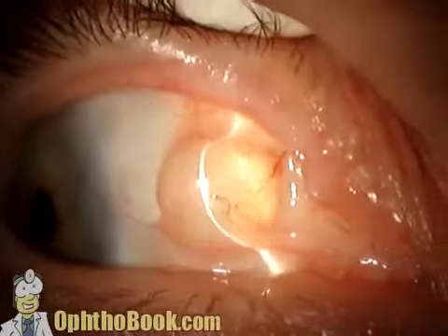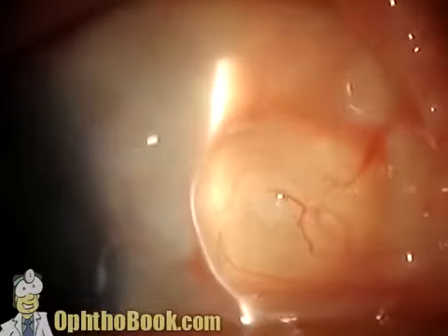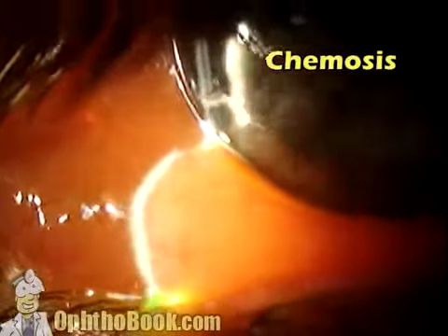It's benign because it's clear, and anytime you have something clear, you can always use your thin slit beam and get a good cross-section and gauge depth a little bit closer. This is swelling over in the white part of the eye. This is chemosis, usually associated with allergy. You get a very puffy allergic response.